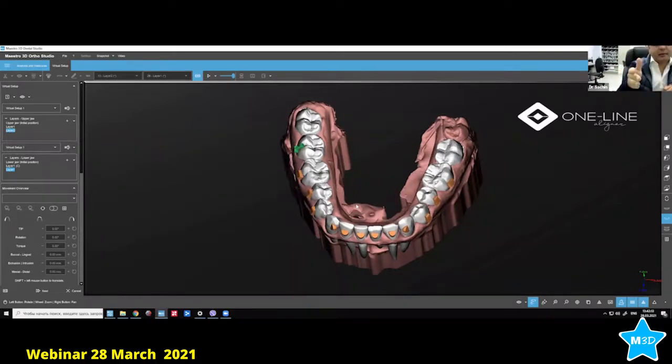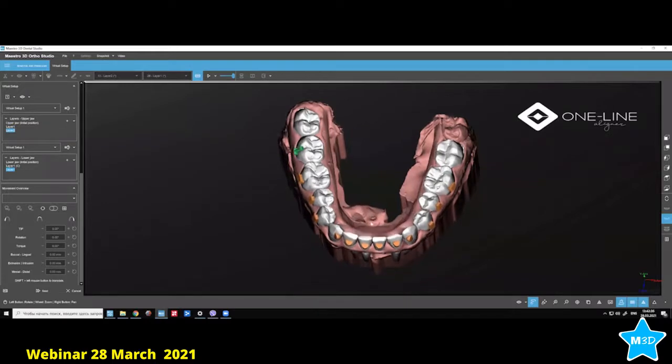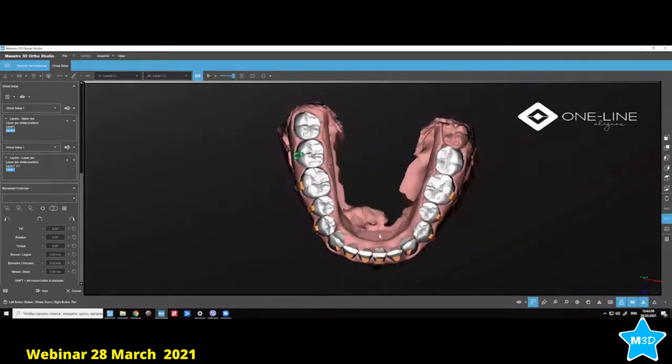And the attachment size is also different. So the attachments on the premolars and the molars are bigger, so automatically the thickness of the sheets will become less. And in the front, they'll keep more, which is actually beneficial for us because we need bigger thickness to make intrusion. The pressure should be more on the teeth, right? Yes, normally yes. Do you change the thickness of the foils? You will say for the first aligners it would be thicker, and the last ones they would be thinner, or would you say this doesn't matter?